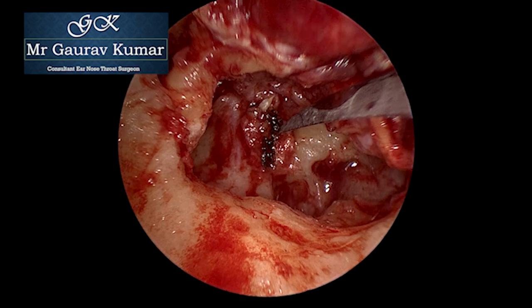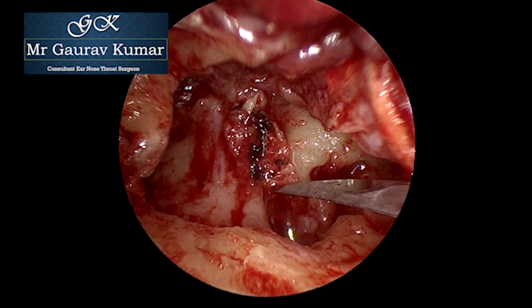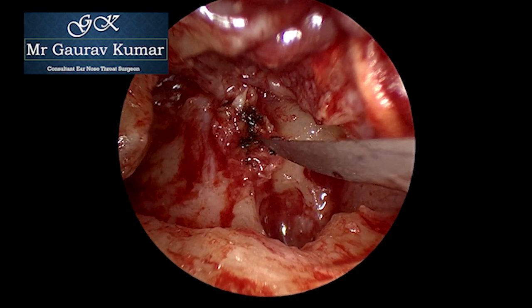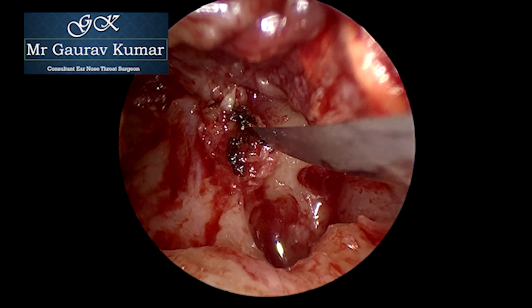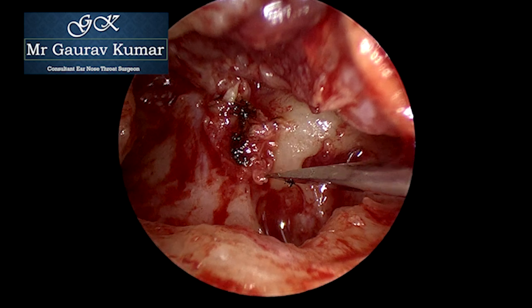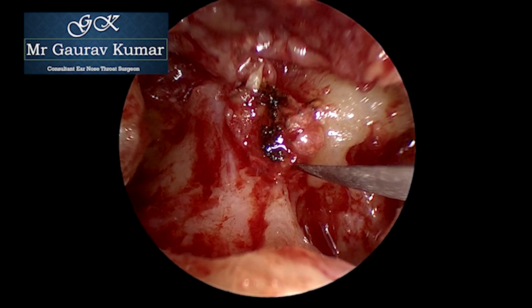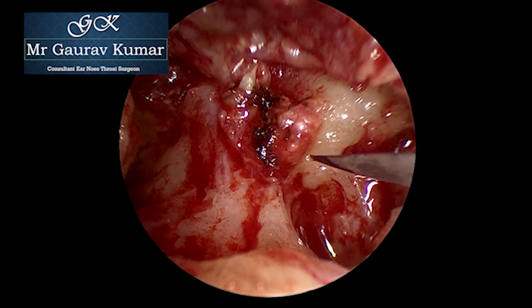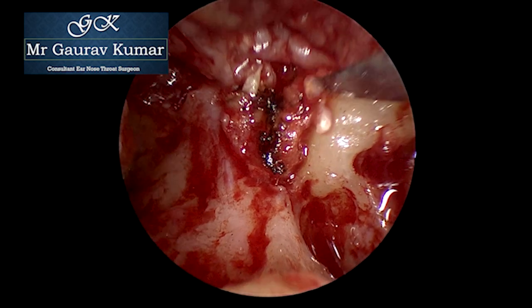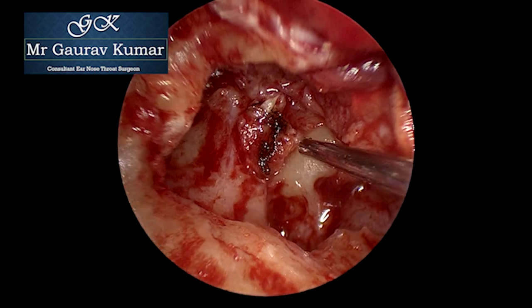Once the laser was complete, dissection was started using the sickle knife, opening the cholesteatoma sac above and below the stapes superstructure. At this point I'm still not sure if the stapes tendon is there, absent, or has been eaten up, but you can see the stapes is quite mobile. Gentle dissection is started from back to front. As we dissected from the posterior segment, it was very clear the stapes tendon is absent and the stapes is a free structure.